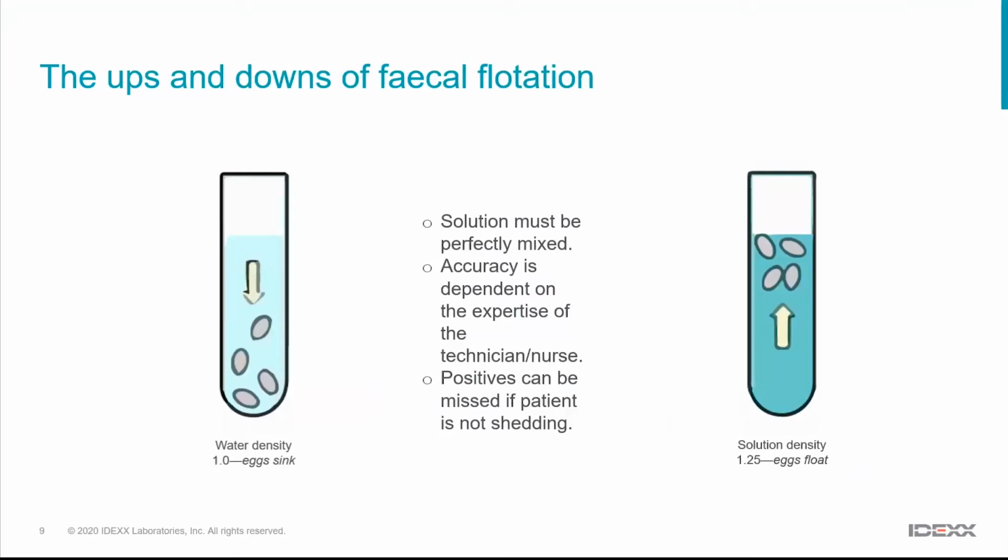So let me say, doing a simple fecal flotation in the clinic is certainly better than not doing any testing at all. So I'm not trying to discourage that, but we've got techniques that can give us more. And the other challenge with this technique is, for the parasites that are in their pre-patent period, we won't see larvae, or even in a period where they could be shedding eggs, not all of them are consistently shedding eggs. So we can get false negative results as a result of that. And that's not because someone hasn't done the test well, it's just the limitation of the technique.